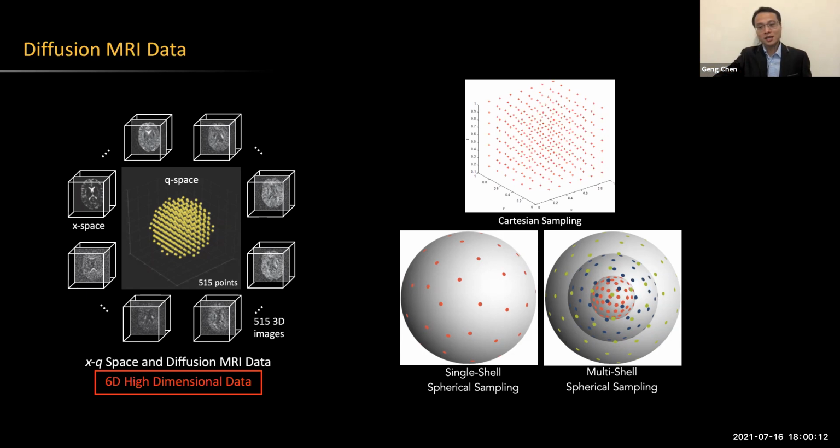For example, for my microstructure work, I just consider the Q space. I represent Q space as a graph. So my input for the deep learning model is this kind of sphere structured data. If you stack these diffusion images together, it is more like a 4D image. Given a spatial location, you can extract a vector. Based on its corresponding gradient table, you can formulate this vector as sphere structured data. And we further represent the data as a graph to use the graph convolutional neural network to finish a certain task. Yeah, I'm not sure if it's clear.